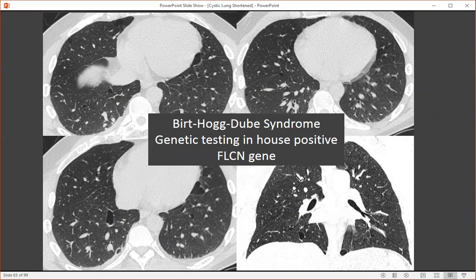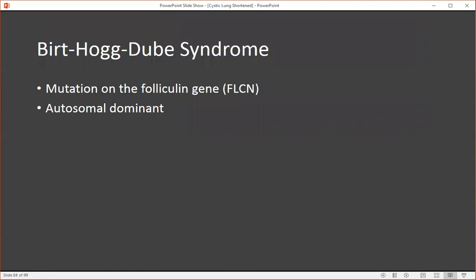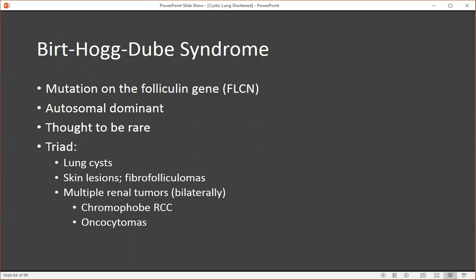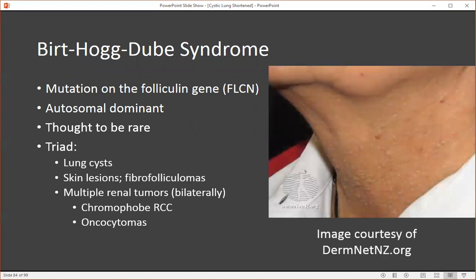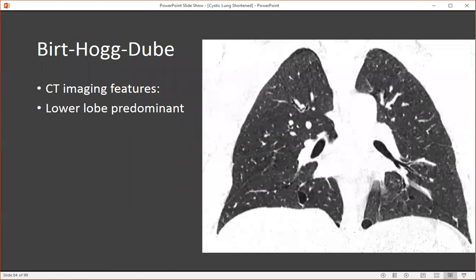So we have an oligocystic lung disease that's lower lung zone predominant, similar to LIP. However, these cysts have a different shape — they're ellipsoid or lentiform — and they're often located adjacent to fissures and pleural surfaces. This was a high-confidence diagnosis of Birt-Hogg-Dubé. This person did not have a connective tissue disease. They underwent genetic testing and were found to be positive for the folliculin gene. Birt-Hogg-Dubé is an autosomal dominant disorder that can be passed to children — it's thought to be rare, although it may just be underdiagnosed.